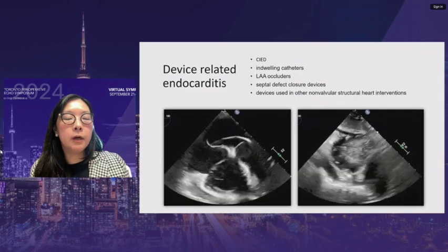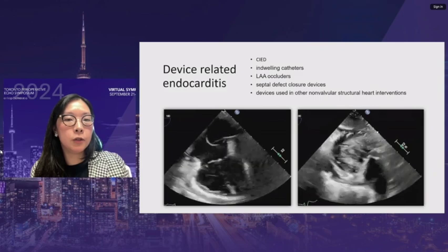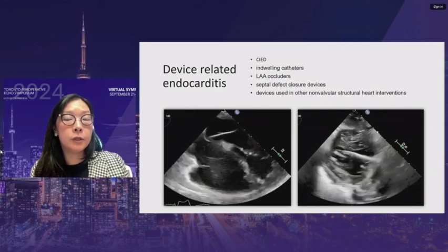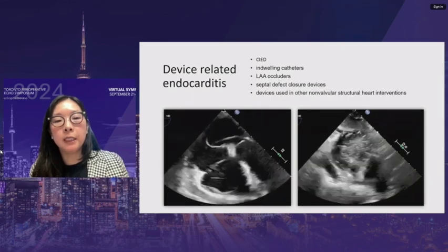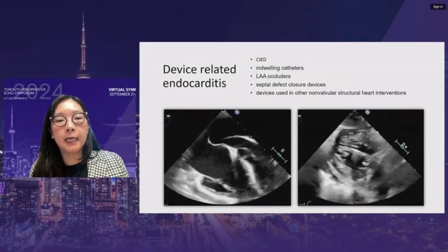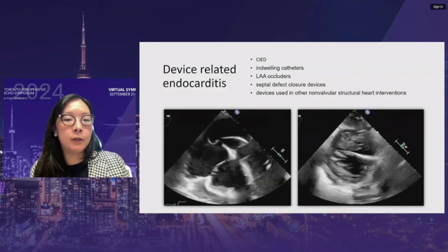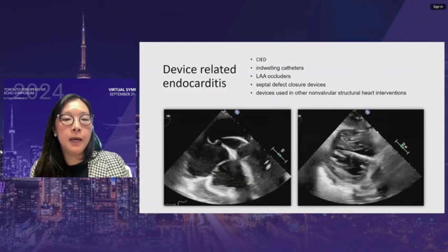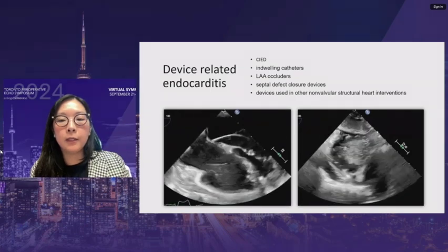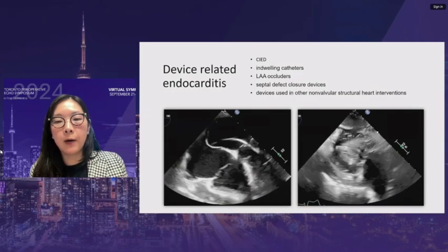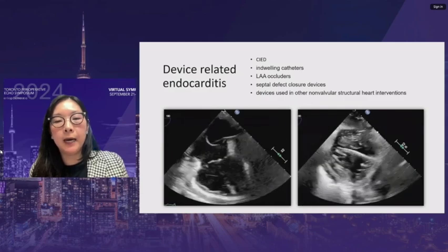Device-related endocarditis includes indwelling catheters, left atrial appendage occluders, septal closure devices, and other structures. When imaging leads, the entire lead must be visualized throughout its path to ensure it is clean. An example shows a pacemaker lead that crossed the interatrial septum into the LV — demonstrating how clean a normal lead appears. Transgastric views are very helpful for looking at the ventricular side of leads.